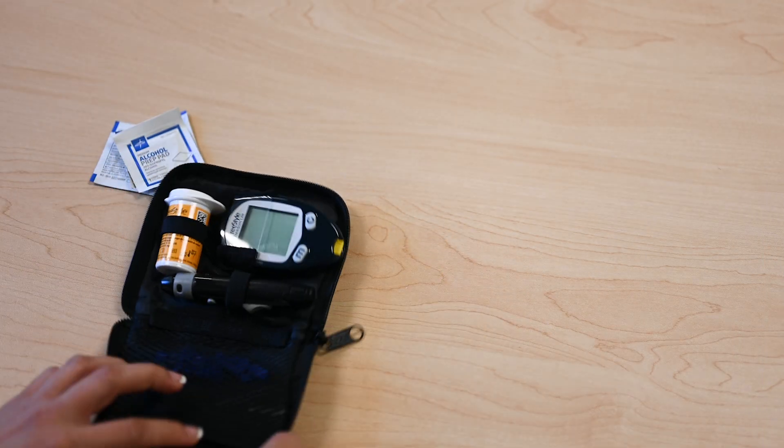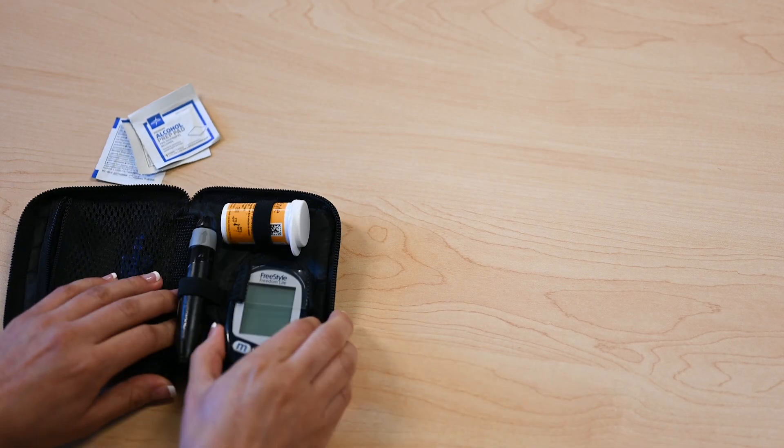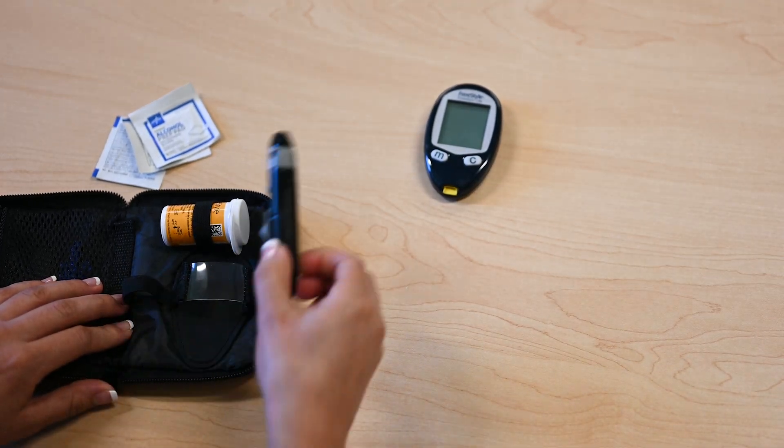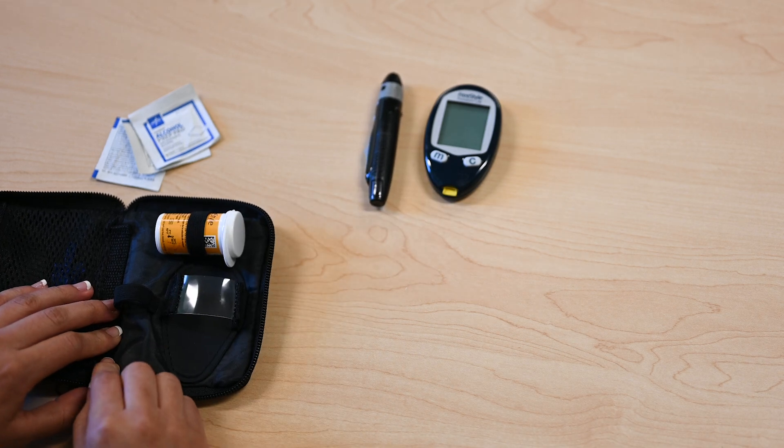Inside the box is the meter, the lancing device, lancets, and the test strips.